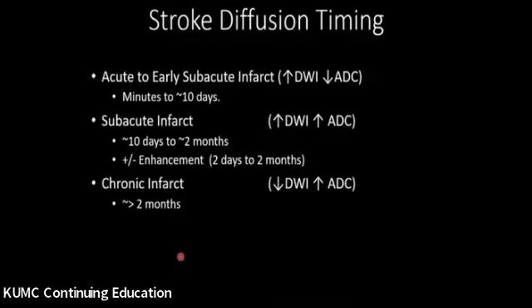Question comes up. Sometimes clinicians want to know, especially if it was a clinically silent infarct you're detecting for the first time, what is the age of these infarcts? Maybe it's a lawyer that wants to know. They like to know such things. But the honest answer is it's very inexact. We can't narrow it down that much.